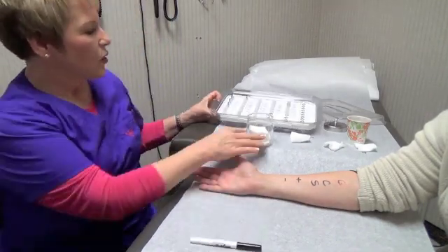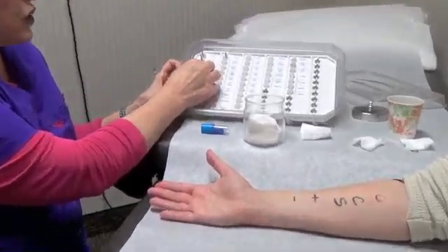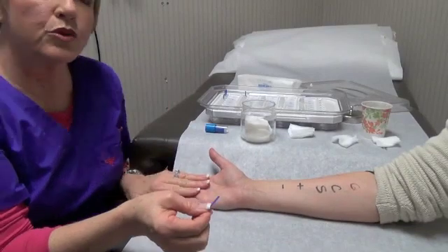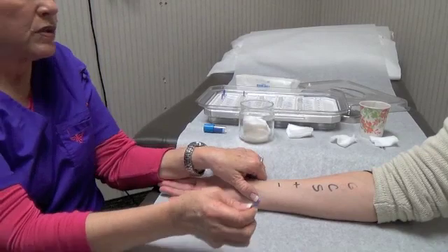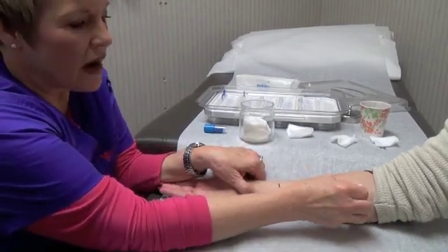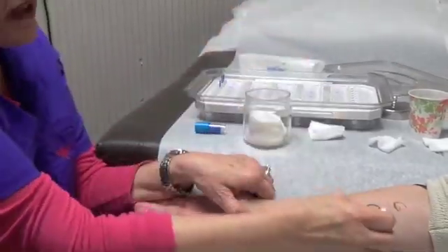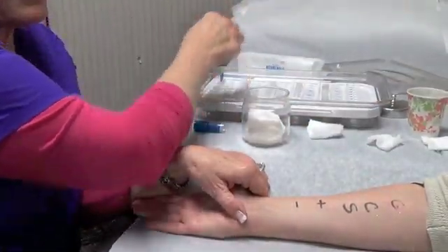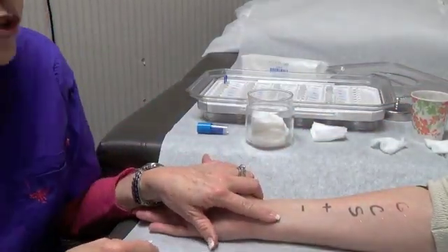As you can see here, the Duotips are submerged into extract containing the individual allergens. The tip is designed so that it holds onto a drop of the extract when we remove it from the testing wells. Then we use that tip to lightly scratch the skin cells, roughing up the top layer of cells and depositing a drop of extract at the test site.